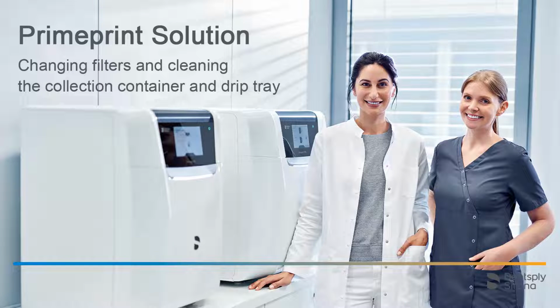Welcome to this video tutorial on the topic of Primeprint Solution. In this video, we will demonstrate how to change the different filters which are built into the two devices and show how the collection container and drip tray can be removed and cleaned.